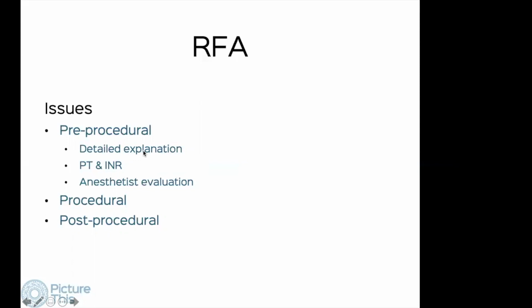We talk about post-procedure pain, which can be quite intense in the first 2 to 3 hours. We also discuss the alternatives, including surgery, just so that the patients are aware why they are getting an RFA done, which is often a little more expensive than doing surgery. Clearly, the INR needs to be normal. Sometimes if the child is young, has a runny nose, etc., we ask the anesthetist to evaluate in advance, but most of the time that's not required.